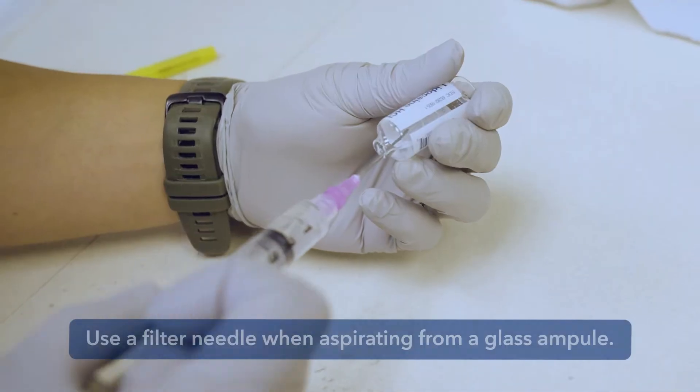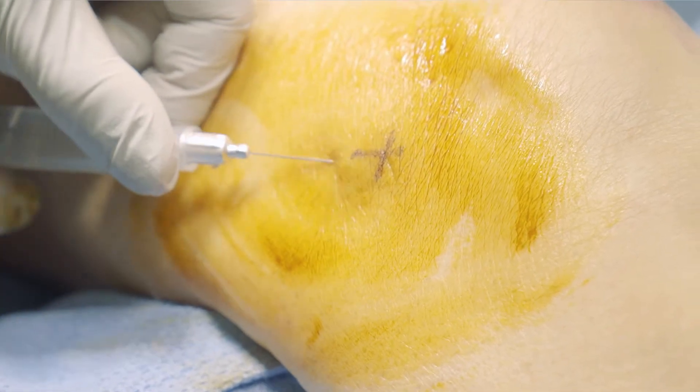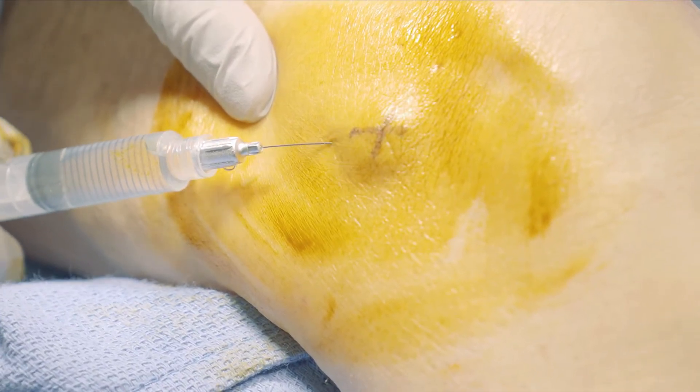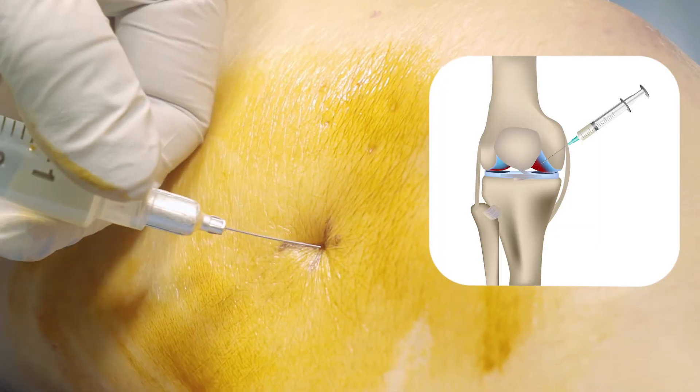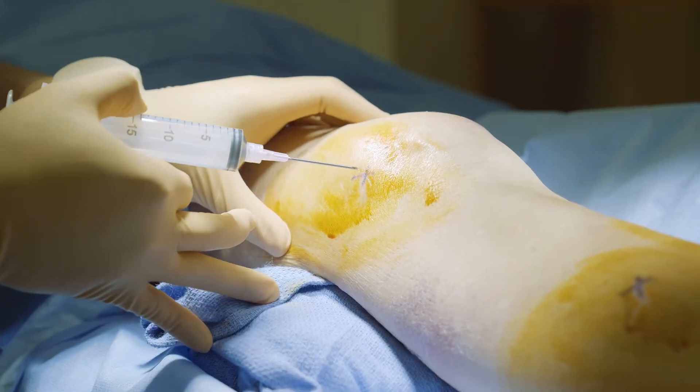Draw up one percent lidocaine and make a skin wheel, then infiltrate the intended track posterior to the patella at the top one-third portion of it. You are aiming for the intercondylar notch, which is deep and slightly inferior to your entrance point.